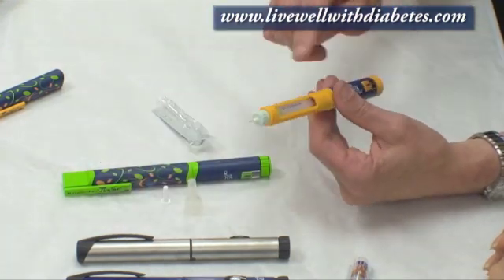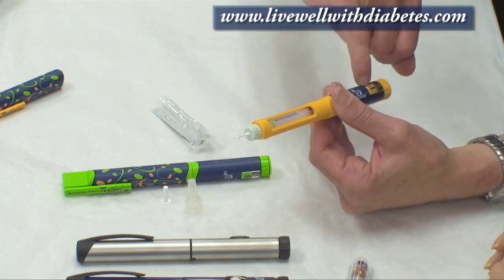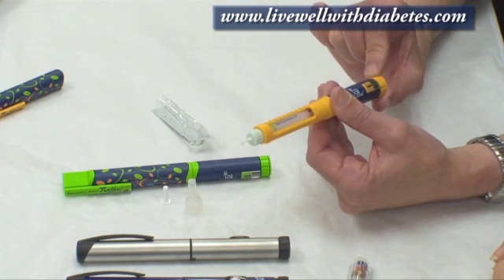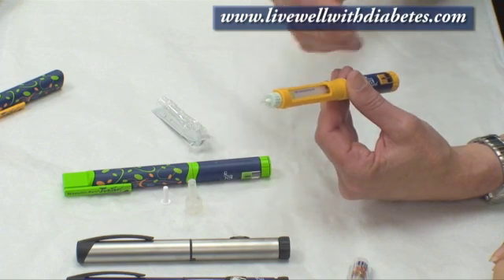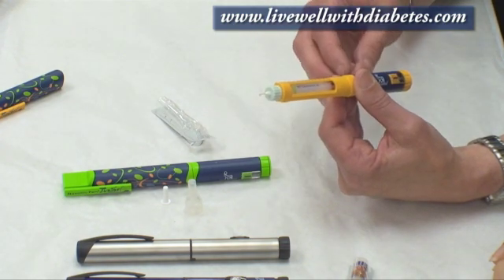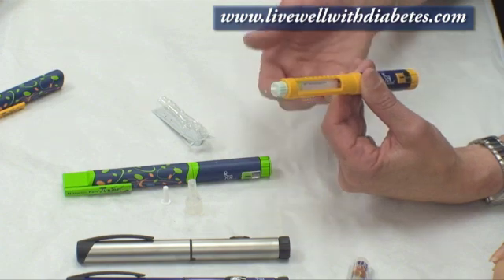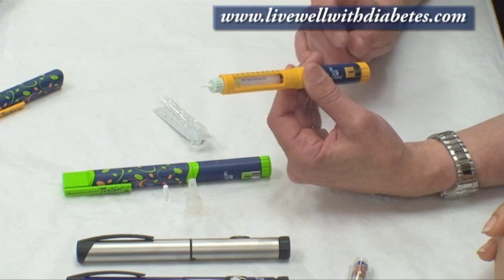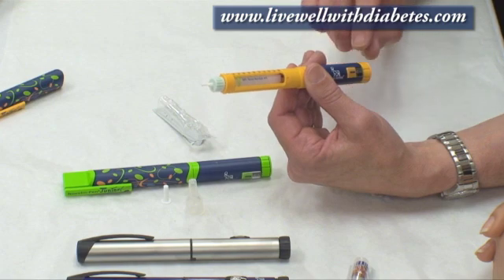On the opposite end of the pen, there's a dose indicator window and it's set at zero, lined up with that solid black line. On the orange end is the dial. When starting a brand new cartridge of insulin, you first want to do what's called priming — also called a safety check. To prime the pen, what you do is turn the dial to number four.